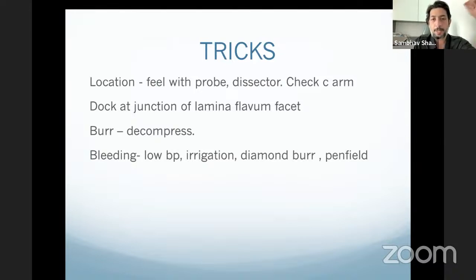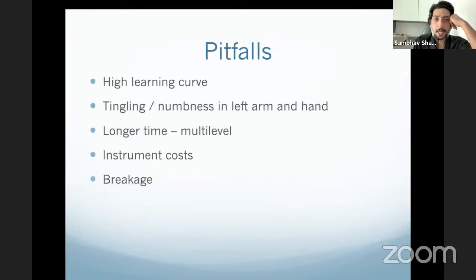You can use pressure pumps for irrigation. You can use diamond burrs, which reduce the bleeding, or you can even use your Penfields and press that area, and just be patient. It is a very high learning curve.